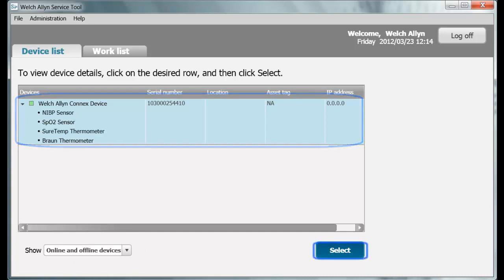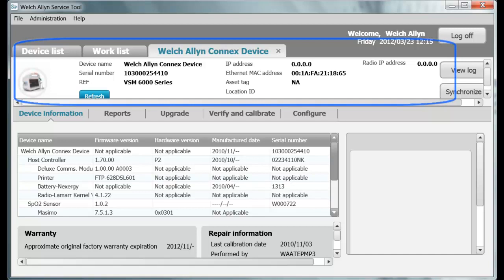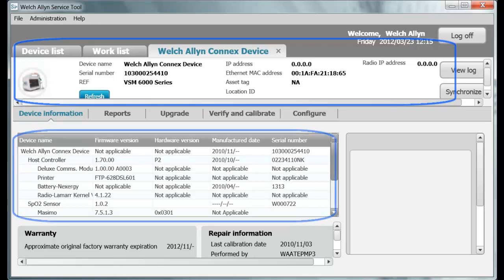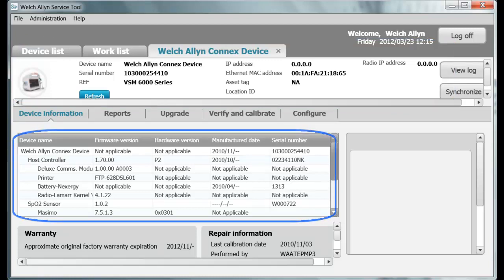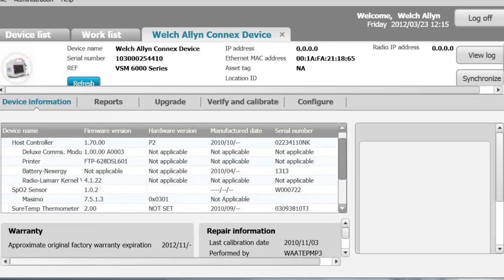Highlight the device and click Select. A new tab for this device opens. The Device Information tab contains multiple sub-tabs that display specific device information such as device name, serial number, IP address, Ethernet MAC address, and the radio's IP address. The device is not connected to a network, so there is no radio IP address shown. The device breaks down into sub-components based on the specific device configuration as listed on the Device Information sub-tab.